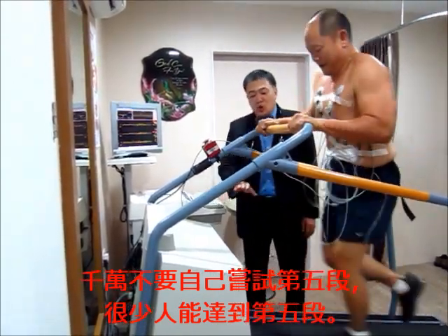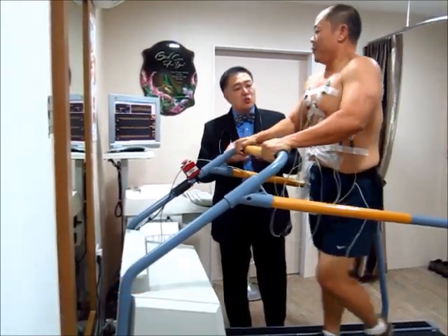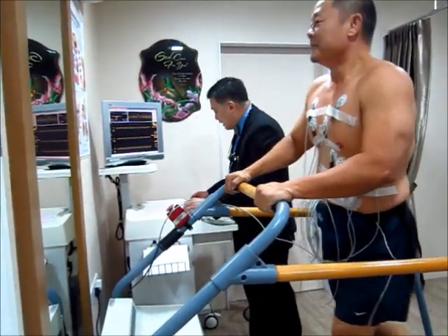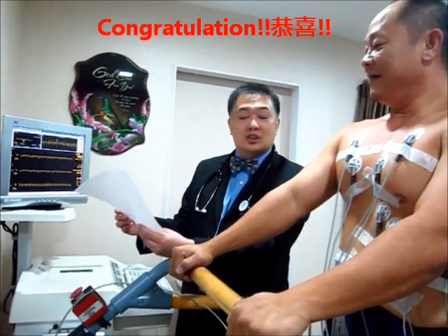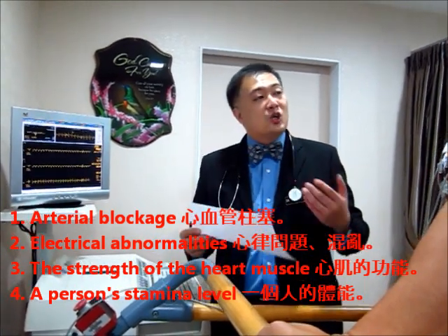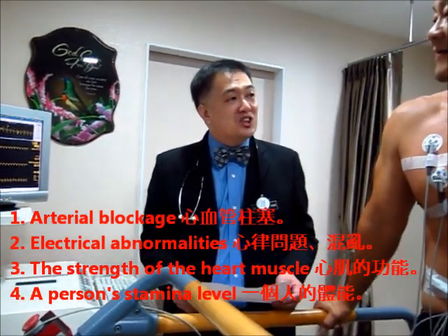Your heart is running at 171 beats per minute and the target is 173 — you've reached 100%. I am now going to slow the machine down. Just walk for a while. Your body is slowing but the heart is still beating very fast, so you may feel your heart pounding against your chest, feel a bit breathless or dizzy, and your legs may feel tired — that is normal. Now I am stopping the machine and looking at your graph. Congratulations — there are no signs of blockage. The treadmill ECG tells you four things: one, you don't have blockage; two, under stress your electrical conduction system did not go haywire; three, reaching stage 5 means your heart muscle is very strong; and four, you completed it comfortably, which means you have great stamina.